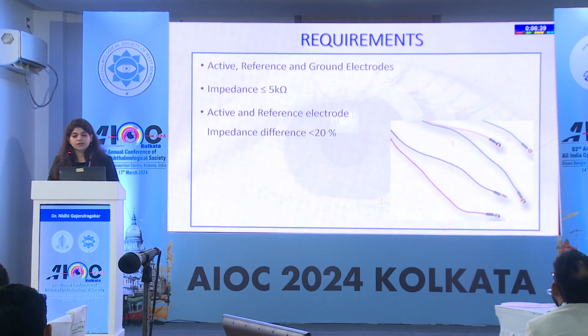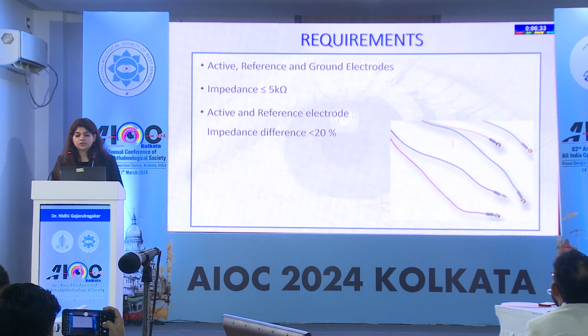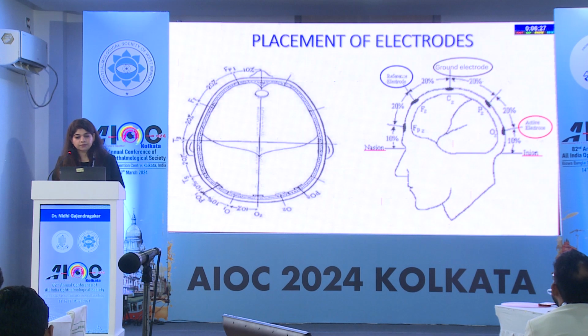So the requirements here: we will have an active, reference, and ground electrode. The impedance should be less than 5 kilo ohms, and between the active and the reference electrode, the impedance difference should be less than 20% always.